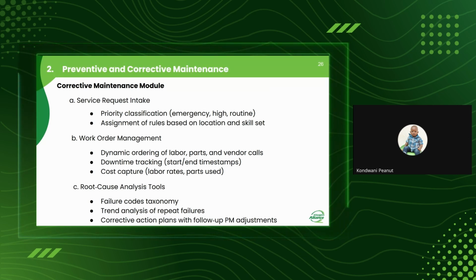But then corrective, it's more like aligning equipment to its original performance. An equipment which was down, but it wasn't really completely down. I would give an example of equipment which is functioning partially. So you just want to bring it up to full functionality. But then it means the same thing because fundamentally you are trying to restore the functionality of a machine. So I just wanted to concur with my friend Brenda.